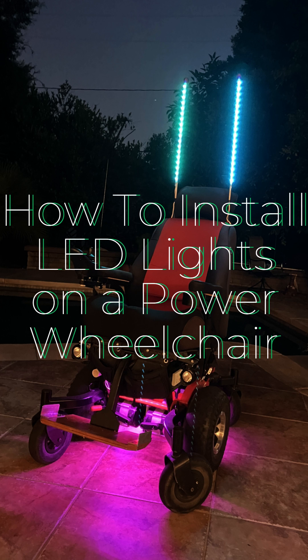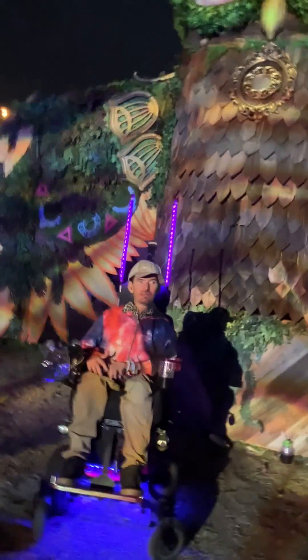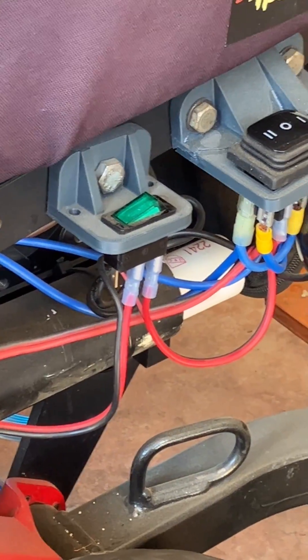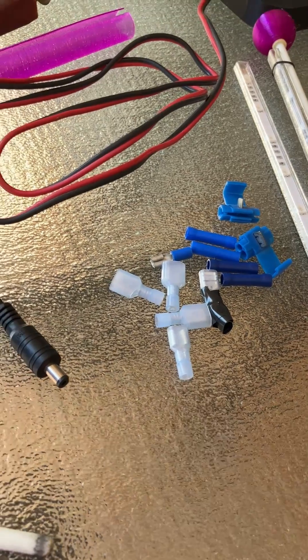How to install colored LED lights on a power wheelchair. You'll need a DC converter, fuse, a switch, the lights, some crimp connectors, and wire.